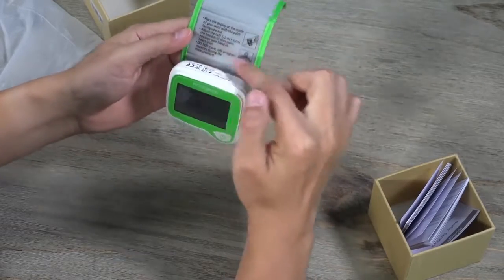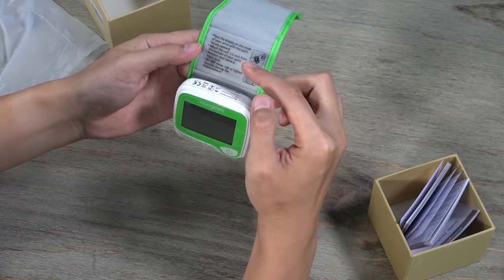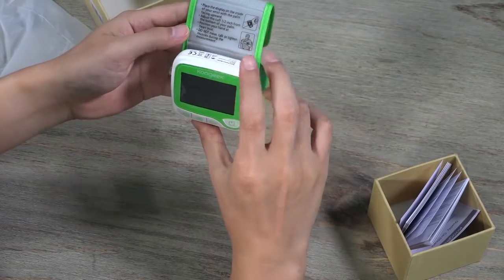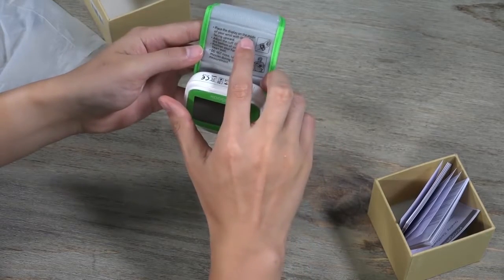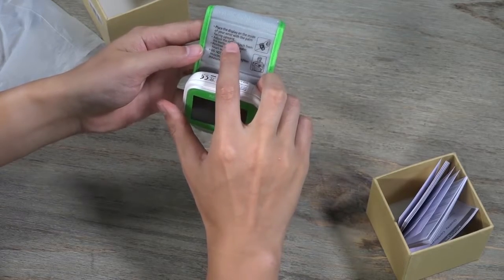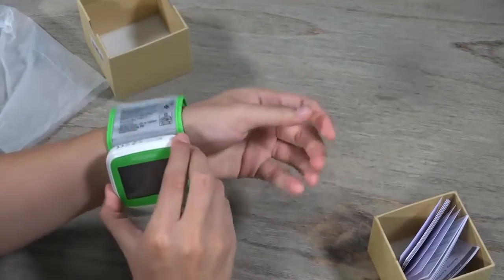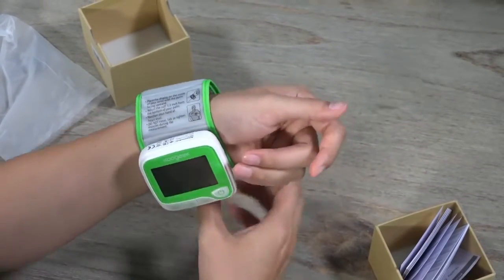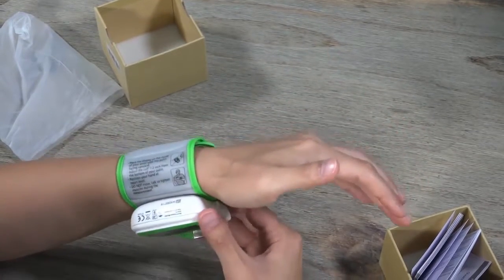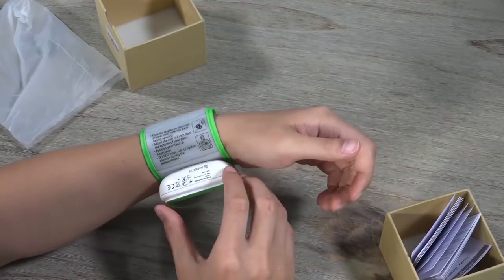Pay attention to this area because this is where you should read before you actually use it. First, you have to place the device on the inside of your wrist with your palm facing upward. I will follow it — placing it on the inside of my wrist.